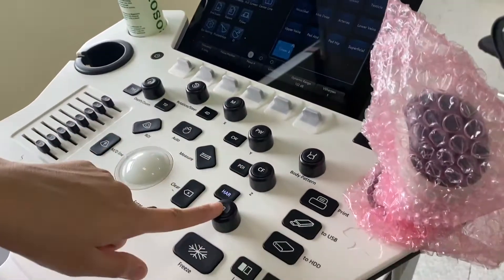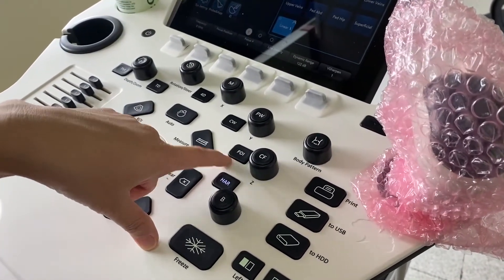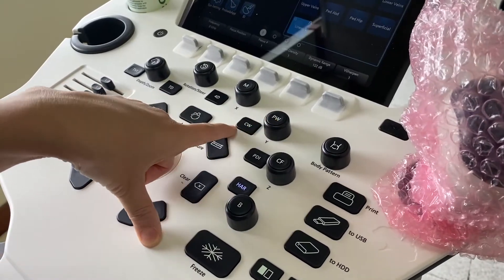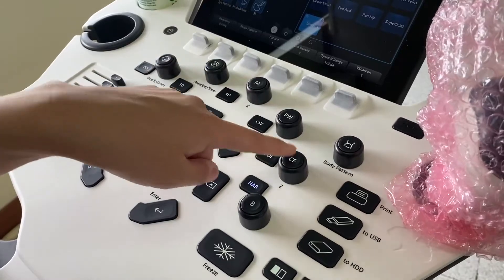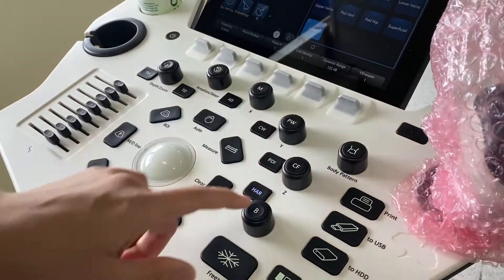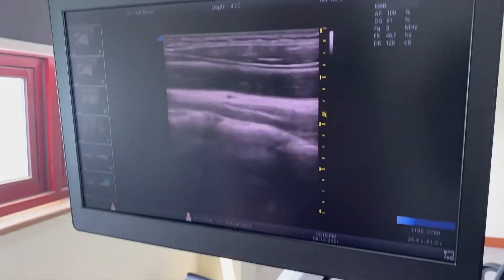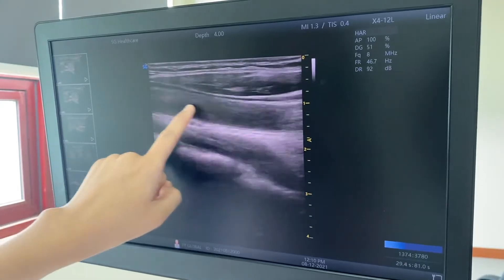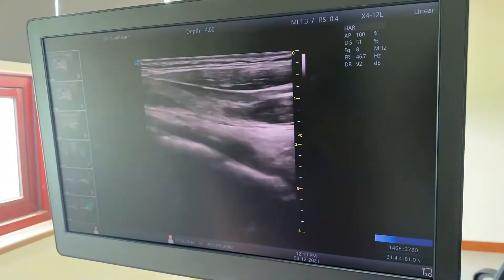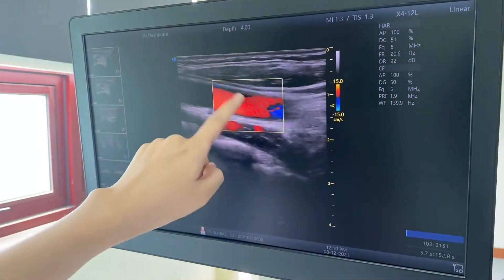B-mode and Color Flow, Power Doppler Image, PW (Pulse Wave), Continuous Wave, and M-mode — basically we have these five functions. In Color Flow mode, this black portion is the carotid artery. Pushing this button allows you to check the vascularity of the vessel.